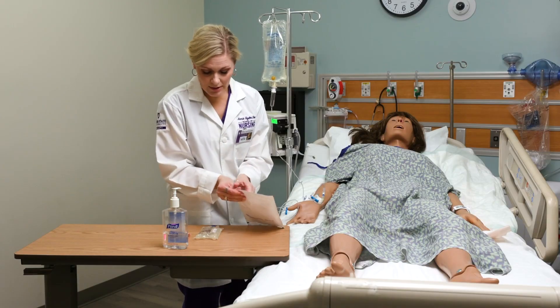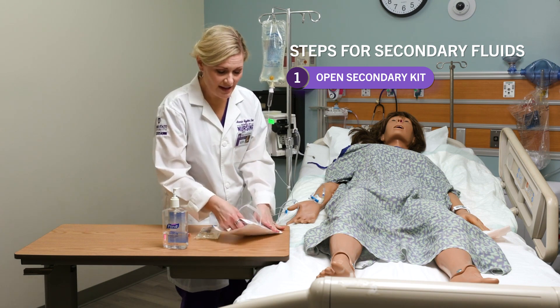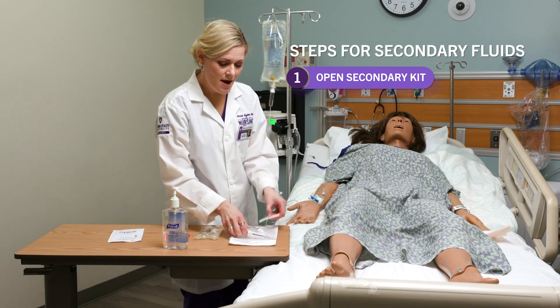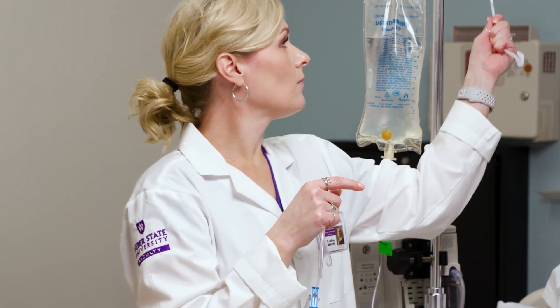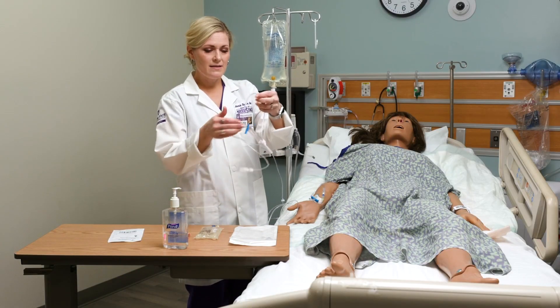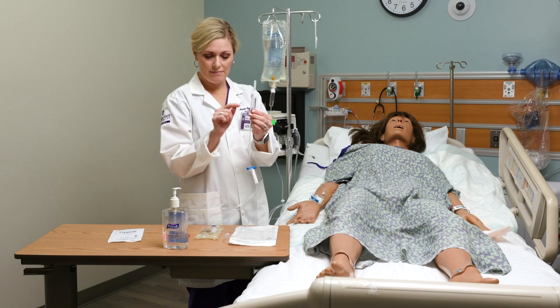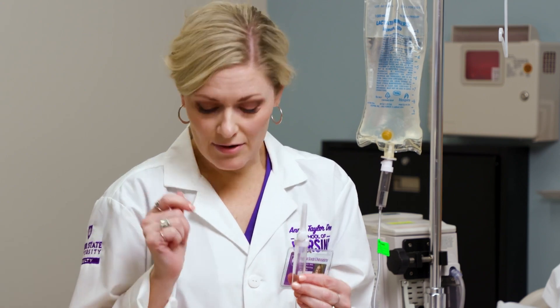There are actually two methods to prime this tubing. I'm going to show you what's called the back priming method — that's the preferred method so we don't waste any medication. You'll see there's a little hook that we're going to use to hook our primary fluids to. This secondary line is much shorter than our primary line, but it still has a roller clamp and a slide clamp, and we need space in that drip chamber so we can count our drips.